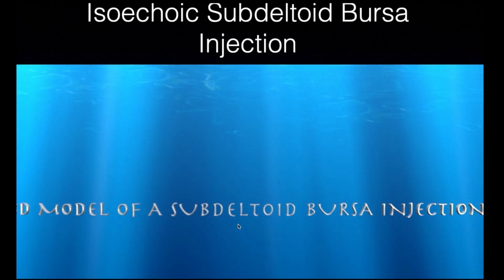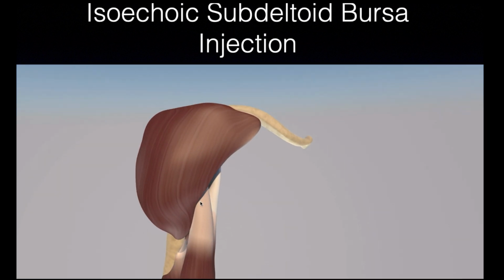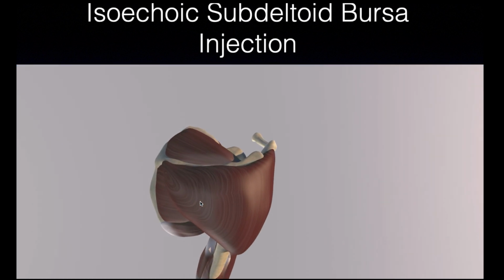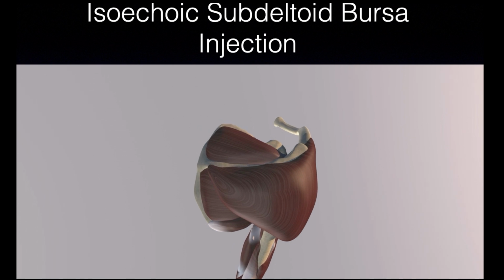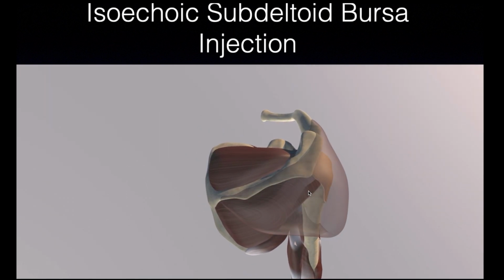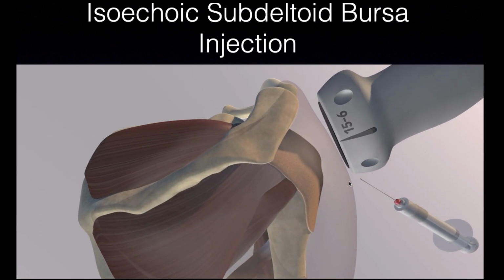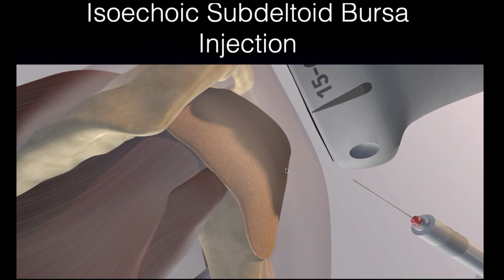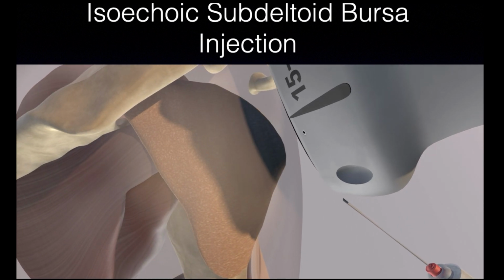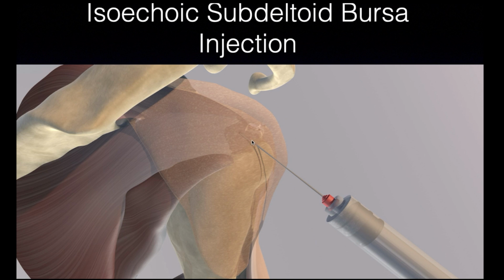And here's my needle going in. So it almost feels like an intramuscular injection for patients because you're really not trying to squeeze the needle underneath the acromion. Here's a little 3D model of kind of doing these procedures. So again, supraspinatus tendon, deltoid muscle, we're making the deltoid muscle translucent. This is an in-plane approach. And we're basically trying to get the needle as parallel to the probe as possible, as Dr. Jacobson mentioned. And we're essentially just trying to get that needle into the bursa itself, above the supraspinatus tendon.